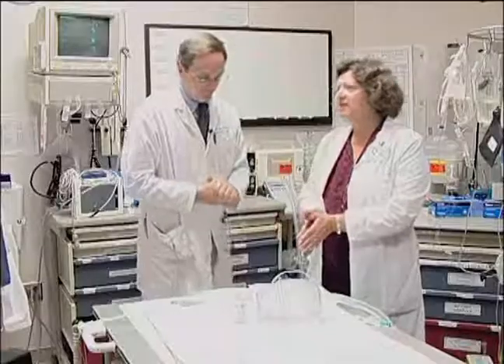And then pitfalls, one of the things on the videotape that I see is sometimes when therapists are bagging, their hands are small and they're bagging really fast with small hands, one-handed. So really think about when you're bagging these patients in here, because it makes a huge difference. You want to give the tidal volume you are thinking about giving and at a rate that's not 22.